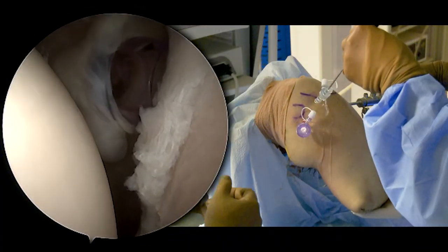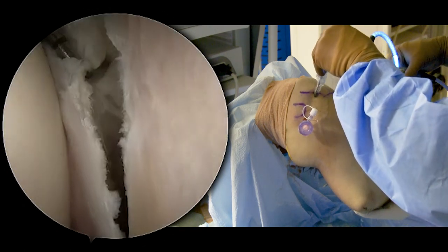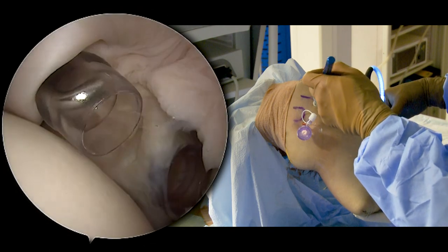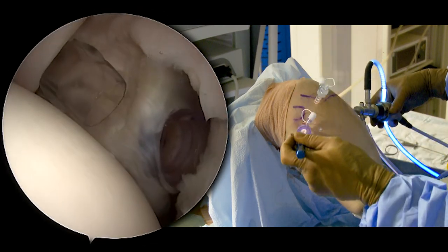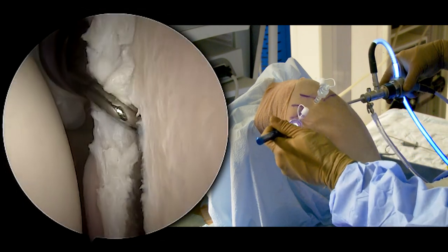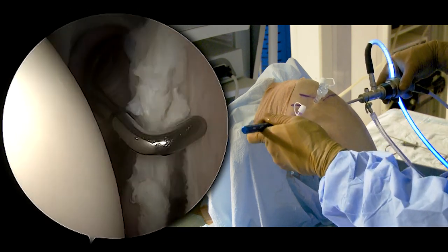This is the left shoulder. We've made a Bankart tear — here you can see the Bankart. We have two portals: a five millimeter cannula superiorly just below the biceps tendon, and then an 8.25 millimeter cannula in just above the subscapularis, which is going to allow us to place our anchors and to use our passing instruments.